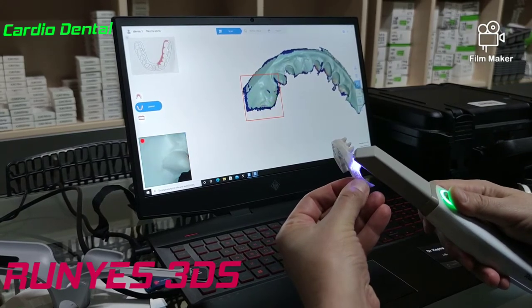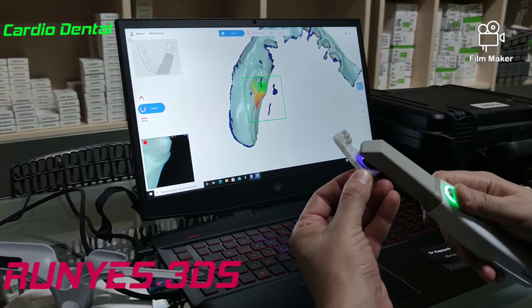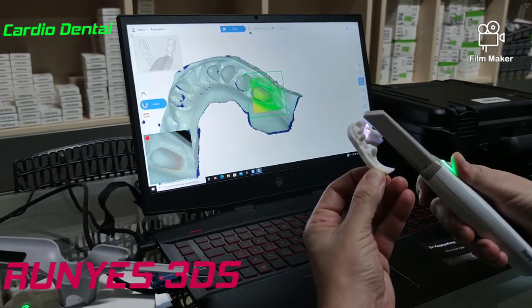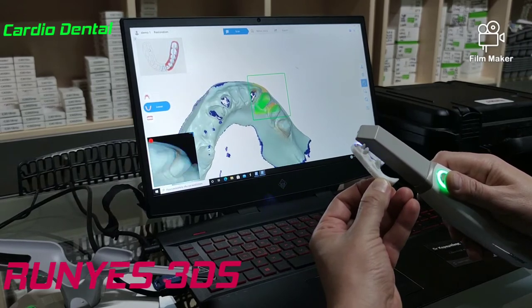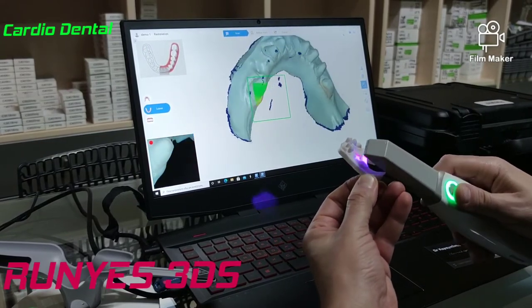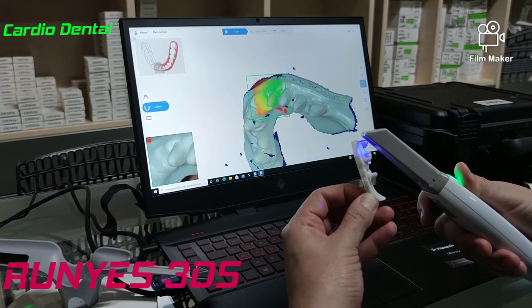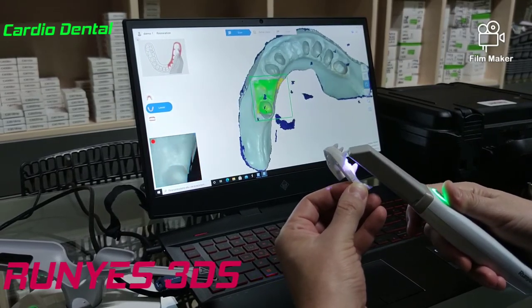The scanning process: we start always from the front side of the mouth, then move back, and then go occlusally. When we have the green mark, it shows that we are very close and we can scan very well. When we have the red mark, it means that scanning has stopped. Now I am going from the lingual side. I want to cover every detail. When we have the blue spots, it means that we haven't scanned those areas yet.